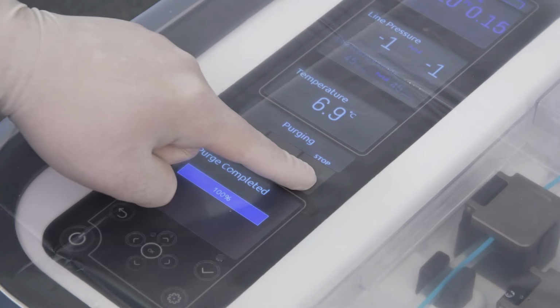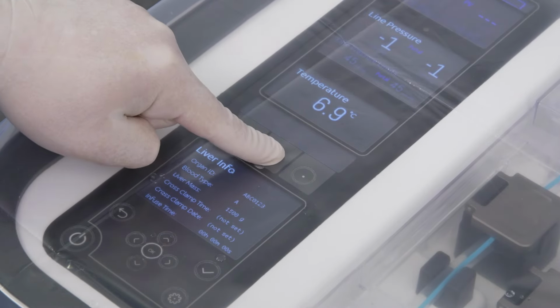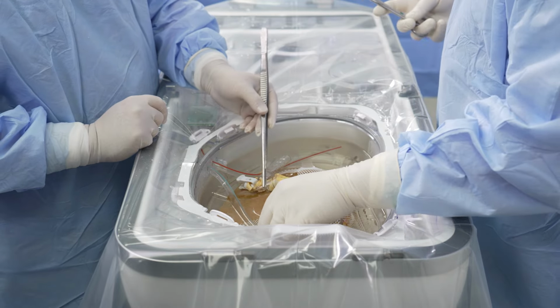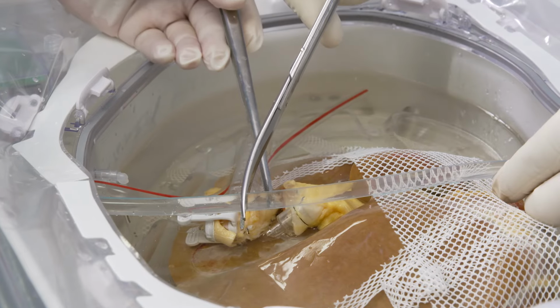Using standard aseptic technique, press stop and then press prime. Before attaching either infuse line to the cannula, determine the optimal length and trim back the line if necessary.